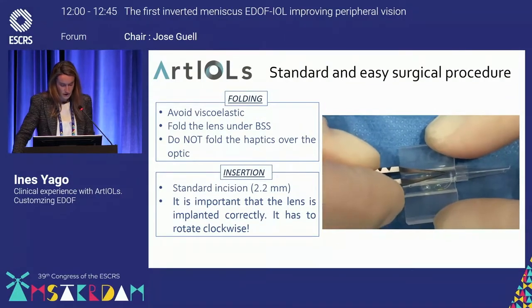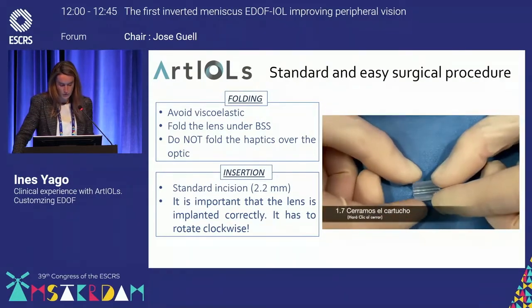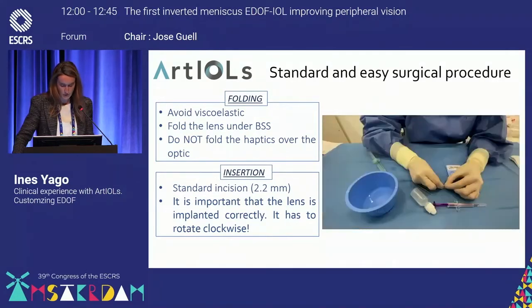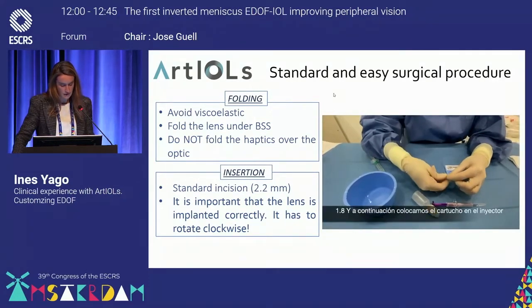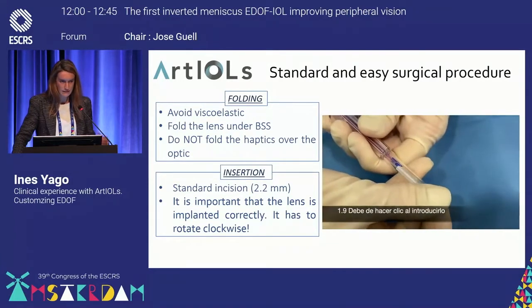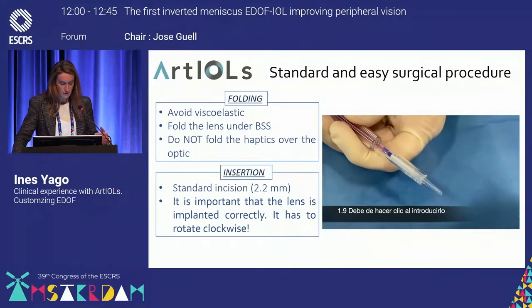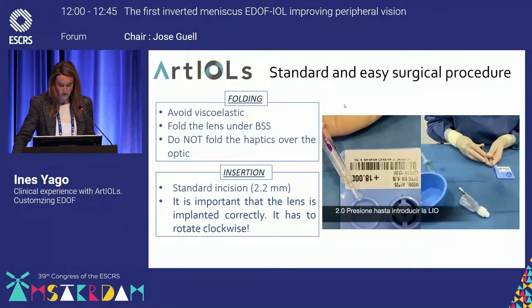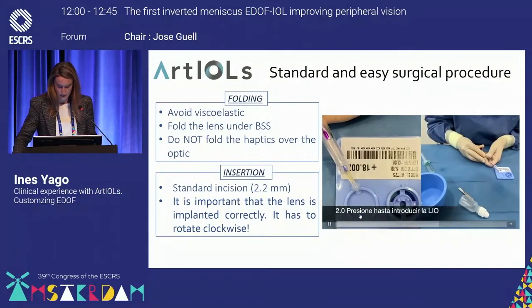I usually do a conventional cataract surgery through a 2.2 incision. I can implant the lens through that incision with no problems. One important thing is that you should make sure that the lens is properly implanted. So once it is inside the eye, you should be able to rotate it clockwise. So that's the way I make sure it's correctly implanted.